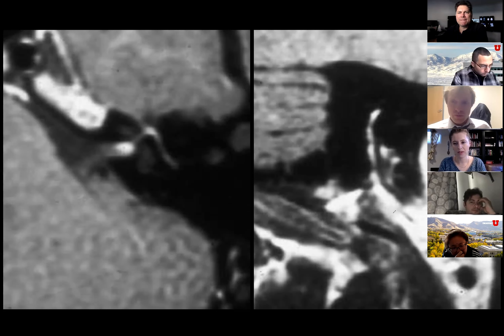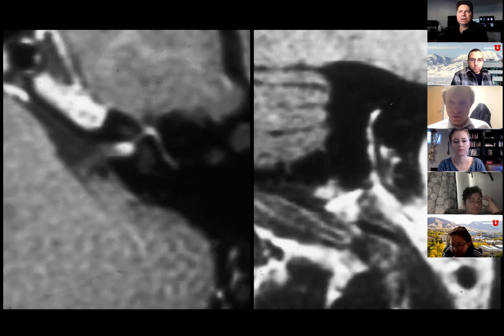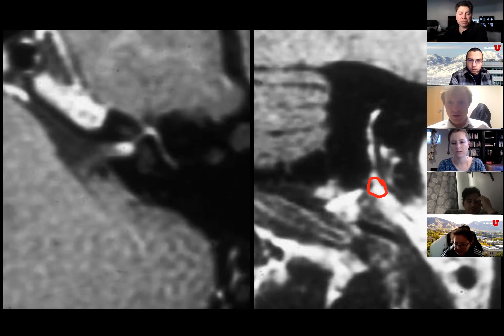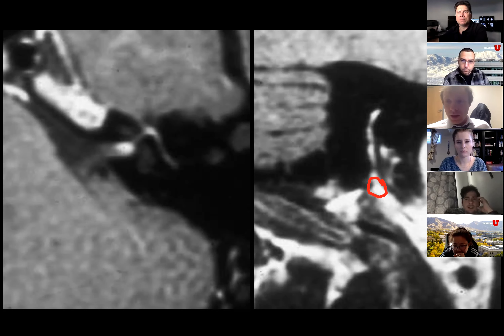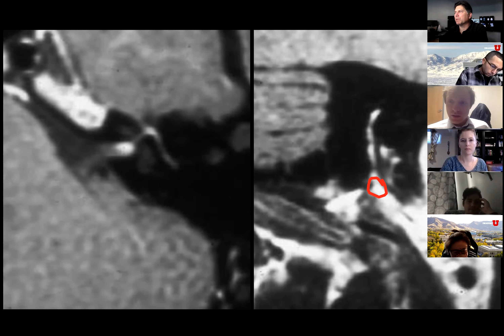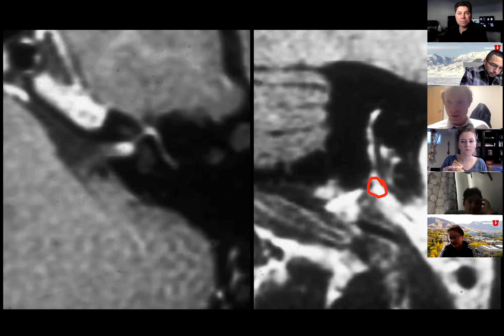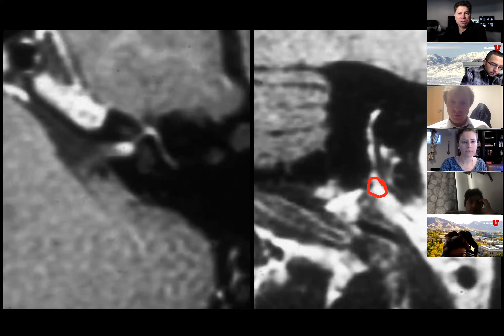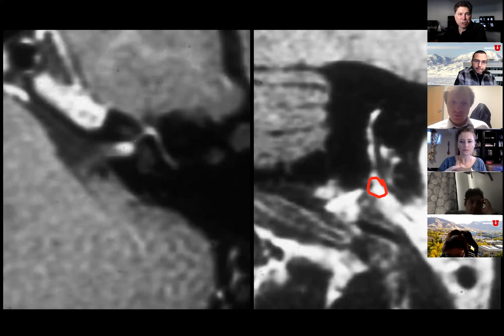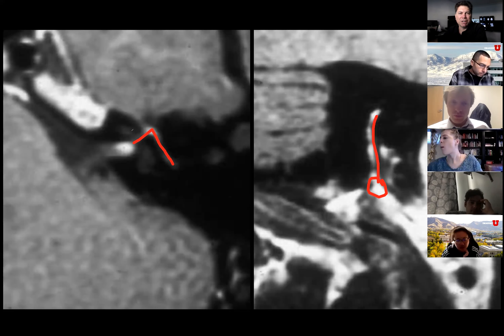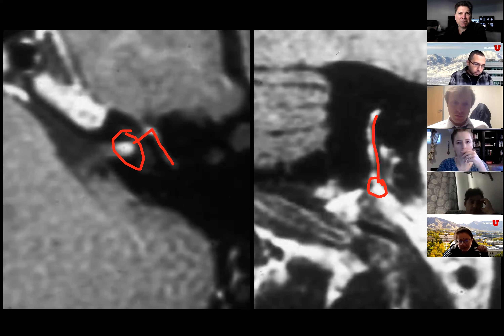Where does the facial nerve exit? The stylomastoid foramen — then it goes into the parotid gland and bifurcates. Anything in the parotid that makes you think of pathology along the facial nerve? Perineural tumor spread — if you have a minor salivary gland carcinoma, especially in the parotid, we want to look at that area. This is a good appearance for herpetic or Bell's palsy — avid enhancement all the way along the nerve with a tuft in the lateral IAC. But you always want to differentiate from perineural tumor spread, like adenoid cystic carcinoma in the parotid.